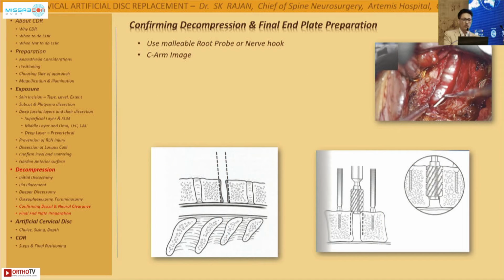Then we're talking about end plate preparation. Another question that often comes up is whether we can use a drill in patients who require disc replacement. Yes, a drill can be used as long as after the complete decompression you are lavaging that area and getting rid of all the bone fragments. End plate preparation has to be very meticulous. You can't overdo it.